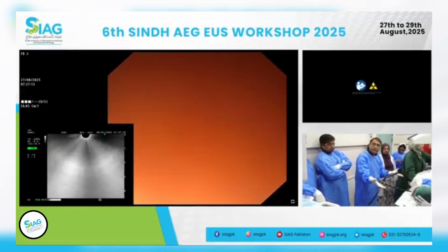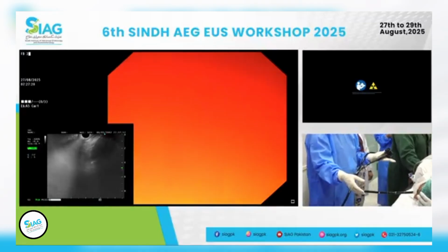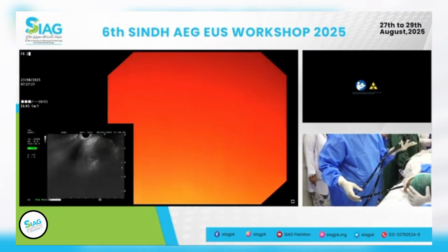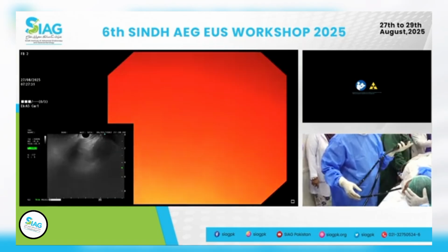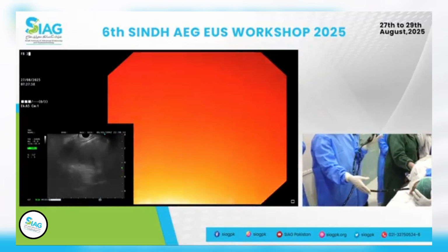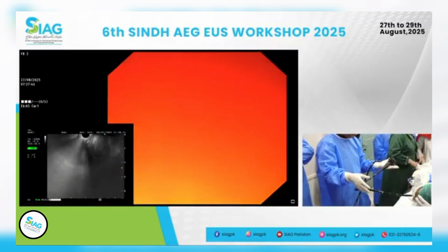You remember, this is what I call the neutral position of the scope. Wheels are facing up. And do you see how far I'm standing from the patient? Because if I'm right here and I do this movement, this is not going to transmit one-to-one all the way to the end of the transducer. You see there is a little bit of movement there on the transducer, but not like that. Step back, keep the scope straight, and look at that, how much movement, same movement which I was doing is transmitted to the end of the transducer.